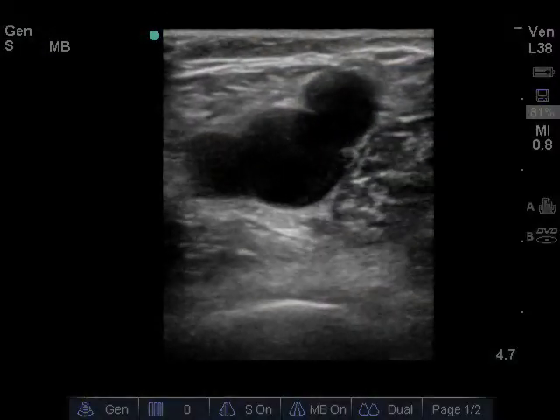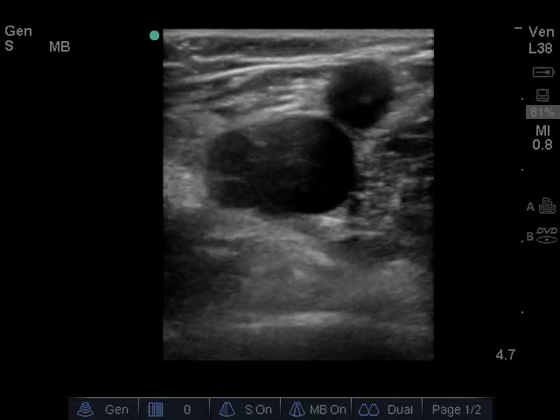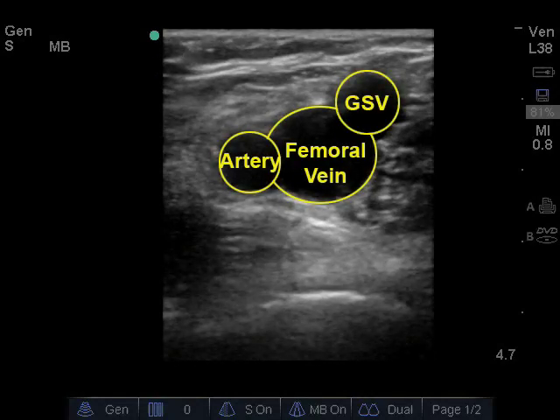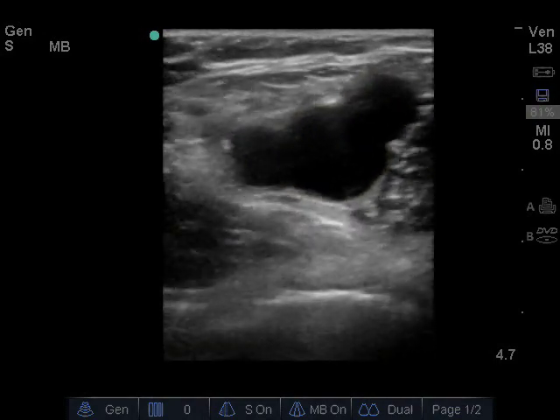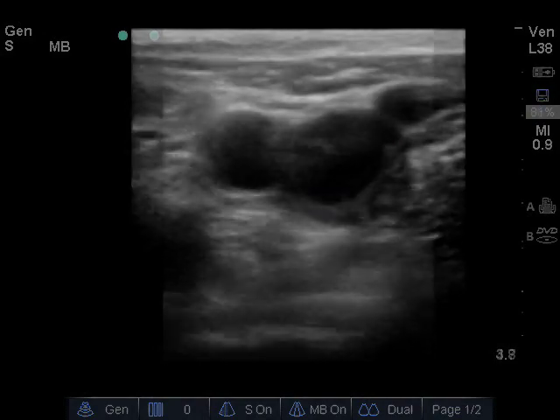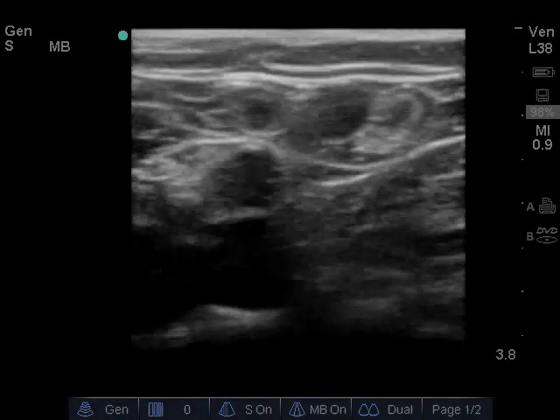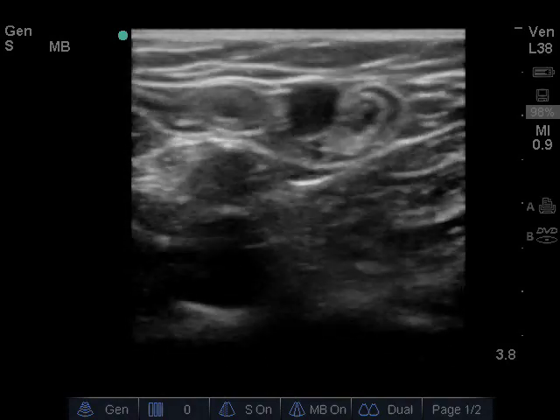Identify the common femoral vein and the femoral artery. The artery is lateral to the common femoral vein and the greater saphenous vein is medial to the common femoral vein. Slide the probe down the leg following the greater saphenous vein distally.